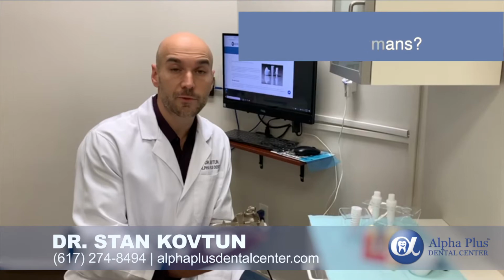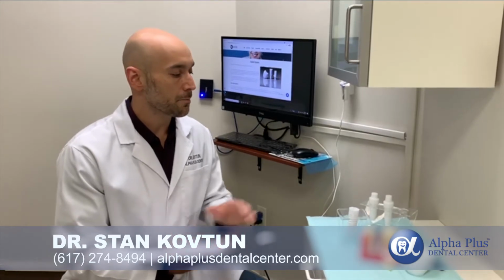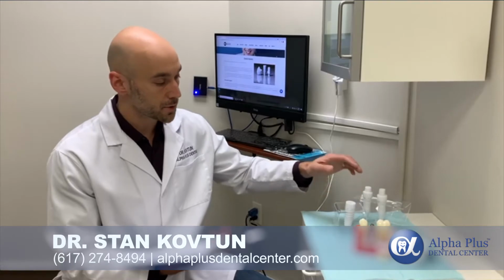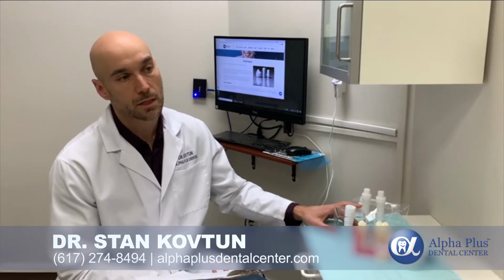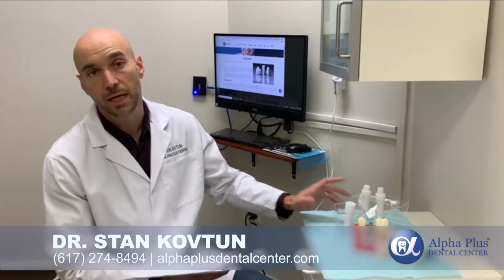So finally, one of the questions is, is zirconia harmful to humans? And again, I kind of covered this just briefly earlier, that it's very inert. So it's an oxide of zirconium. So we work with zirconia, and zirconia is essentially a ceramic material that's very inert for us. So there have been 0 allergies to it that we know of yet.